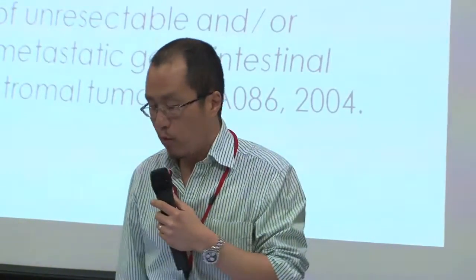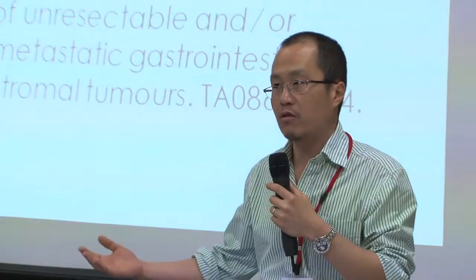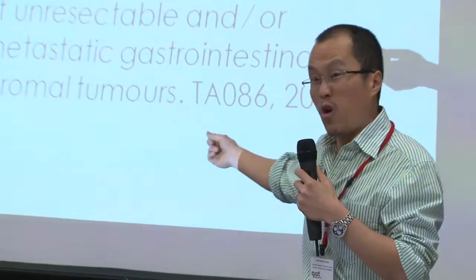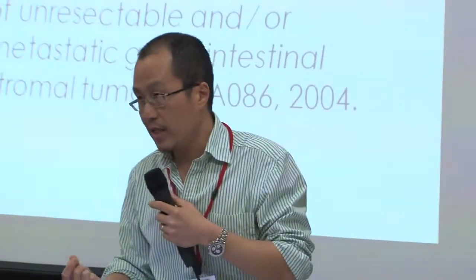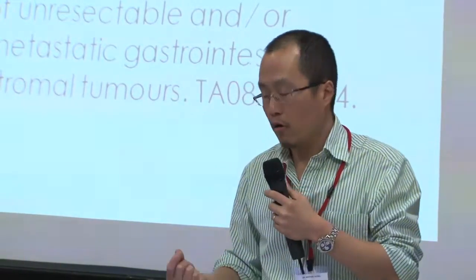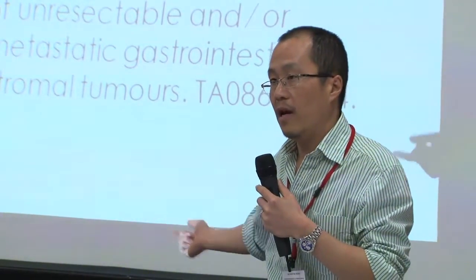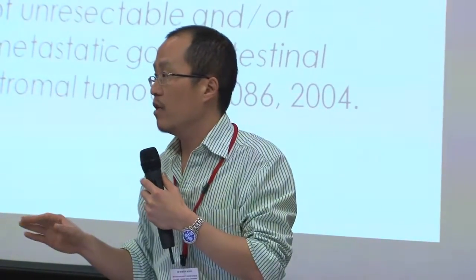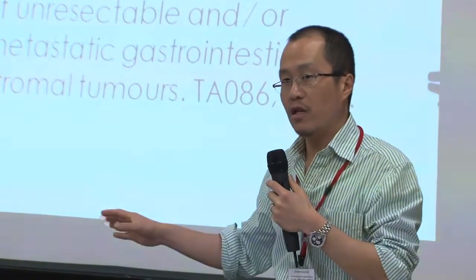And in fact, that's important. It's an immunohistochemical technique. It's particularly important because, compared to CD34, which stains about two-thirds of GISTs, CD117 stains almost all GISTs, maybe all but about 5%. And the expression of c-kit in GISTs became very important to certain governing bodies and organizations like NICE when they produced their guidelines on imatinib use in 2004. That guideline dictated that anyone's GIST had to express CD117 in order for it to be treated with imatinib. Now we know that's slightly misguided, and we've changed our practice since.